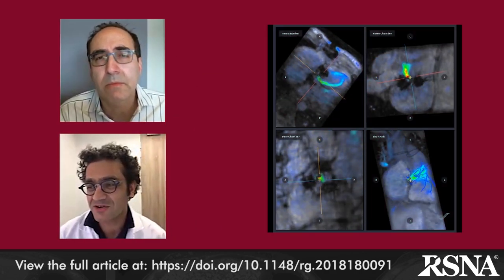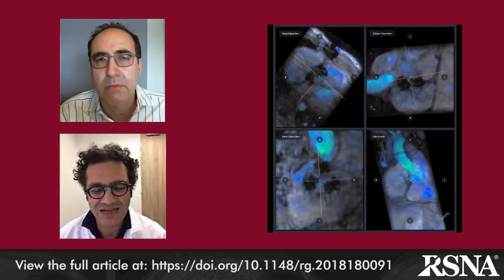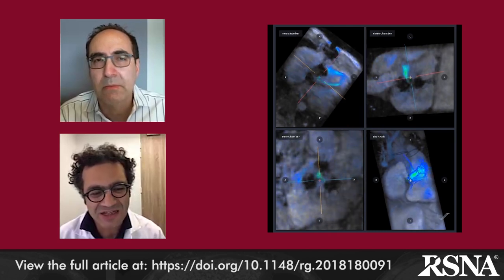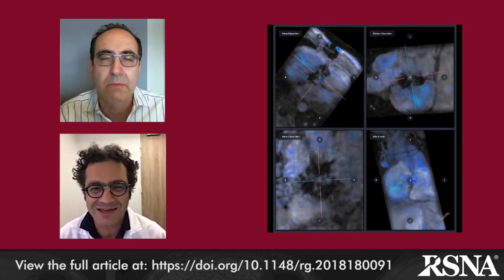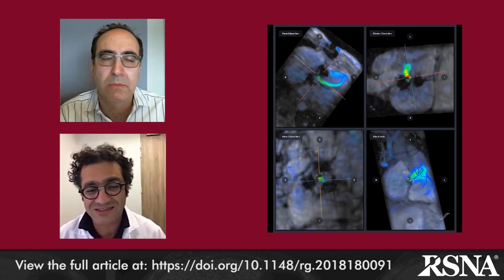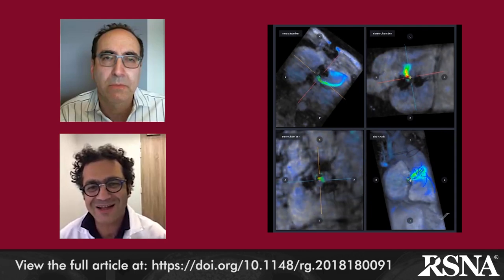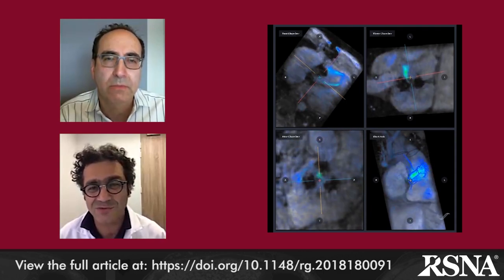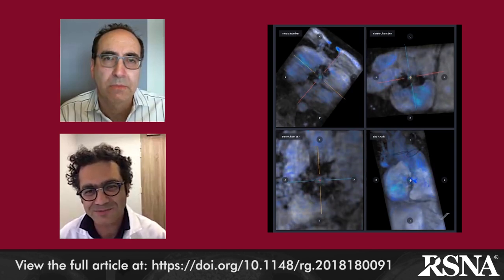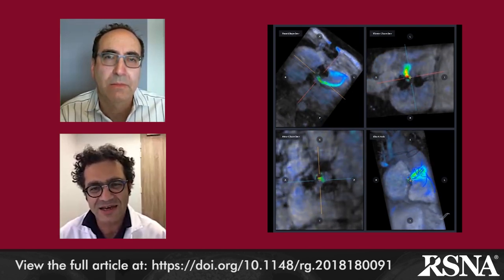Of course, cardiac echography is the first step. But we know that there are some limits, and prosthetic valves can be a limit because they have a lot of artifacts in echocardiography. The other limit is everything happening on the right side, in the right ventricle, with the tricuspid valvular prosthesis, which is even more difficult, and the pulmonary valves, also prosthetic valves, are very difficult to assess with echocardiography. So these are very important parts where 4D flow MR can really help cardiologists to better understand and to better assess these leaks or dysfunctioning of the prosthetic valves.